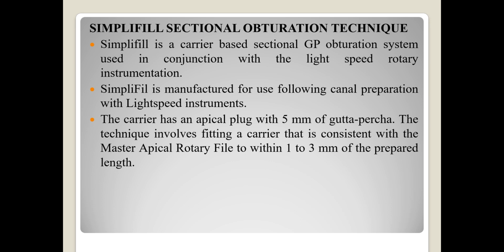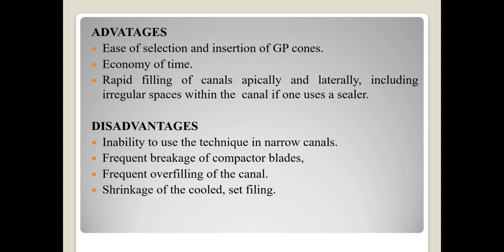SimpliFill sectional obturation technique. SimpliFill is a carrier-based sectional GP obturation system used in conjunction with LightSpeed rotary instrumentation. SimpliFill is manufactured for use following canal preparation with LightSpeed instruments. The carrier has an apical plug with 5 mm of gutta percha. The technique involves fitting a carrier that is consistent with the master apical rotary file to within 1 to 3 mm of the prepared length.